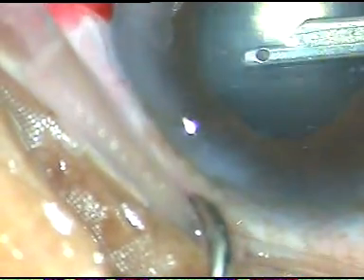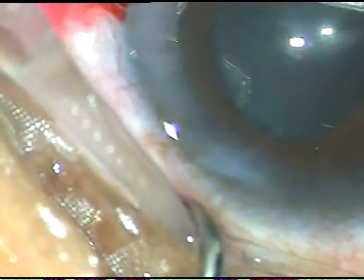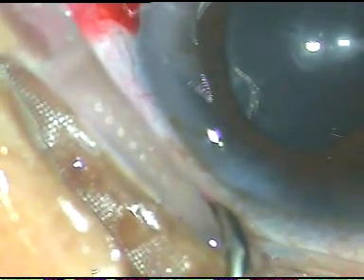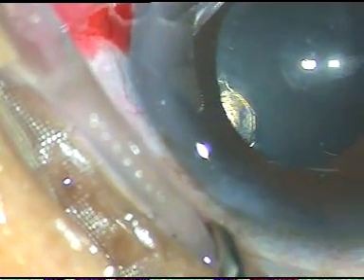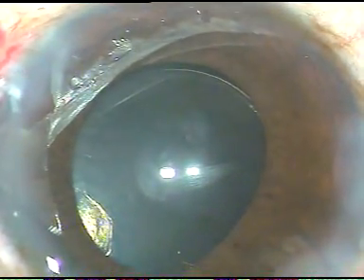That's it. The case is nicely done. Now, the capsulorhexis was done by a trainee fellow. She didn't stain the anterior capsule properly. She could not see properly, but still she tried to do. This should not happen. We must do what we can see.